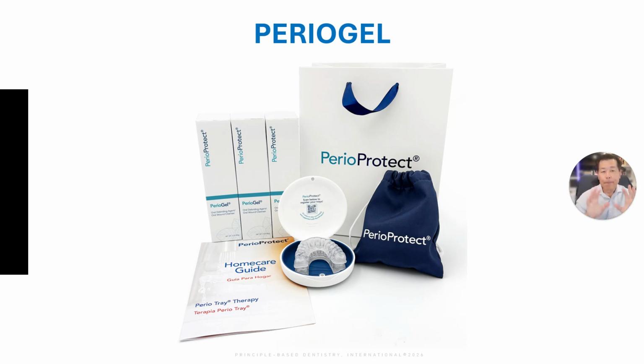So remember, at the end of the last segment, I said we're going to talk about minimally invasive ways of taking care of that red biofilm. And one of our favorites has been using Perio Protect trays, the Perio gel. Very easy, very cost effective, can save patients a ton of money. Like if they've got some inflammation and you may be thinking they're borderline, maybe you need a root planing and scaling, that could be thousands of dollars.